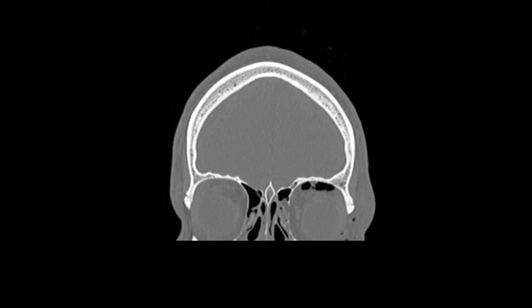This is a coronal bone-enhanced CT slice with the patient looking out the screen towards you. Perhaps the most important thing to notice immediately is that there is gas within the left orbit and around the orbit within the periorbital soft tissues. This patient suffered trauma, and you can see that there is a fracture through the left medial orbital wall.